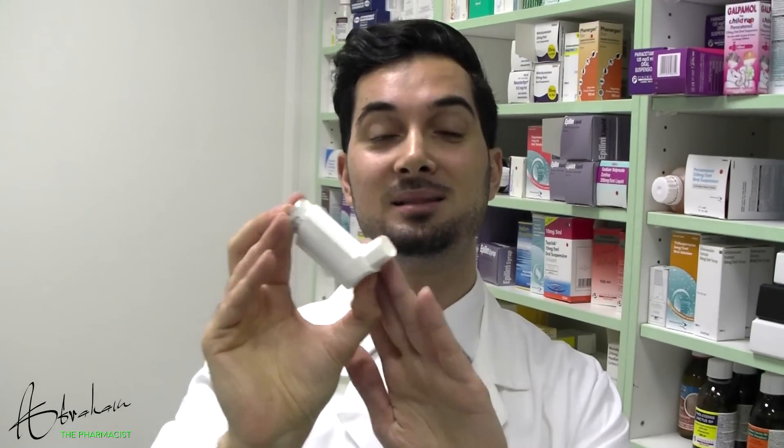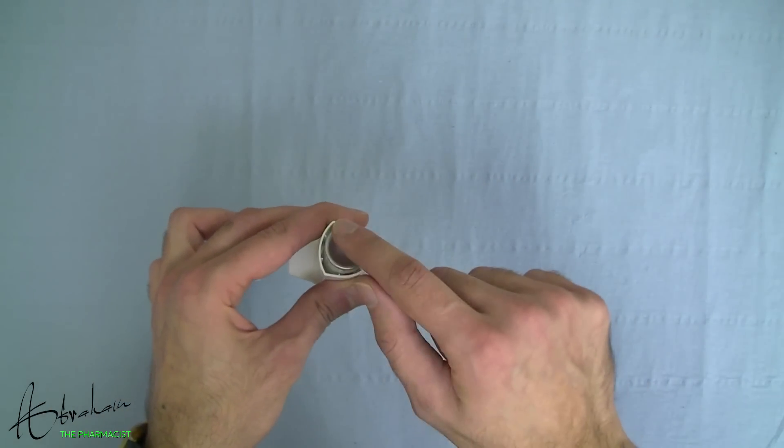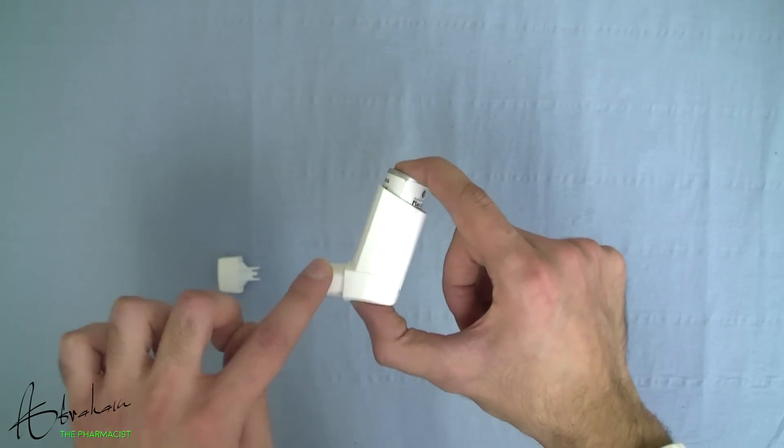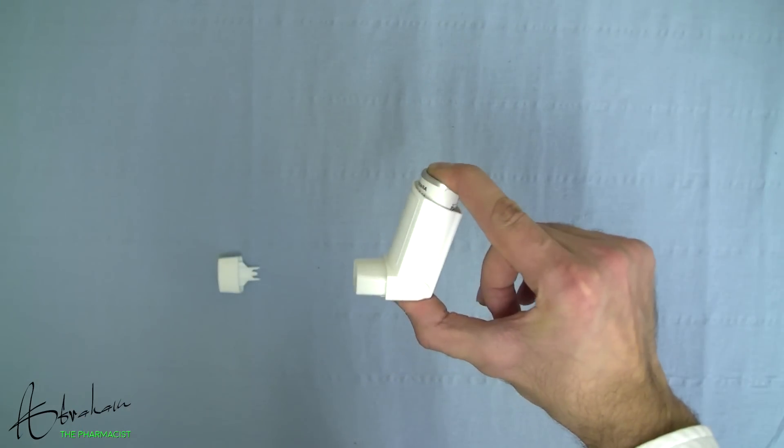This is my placebo inhaler — it will have a different colour to your inhaler, but the mechanism on all of them is the same. Here is a small canister which contains a mixture of medicine and propellant, held in a plastic case called the actuator. When you press the canister down, the actuator nozzle produces a fine spray which you breathe in.